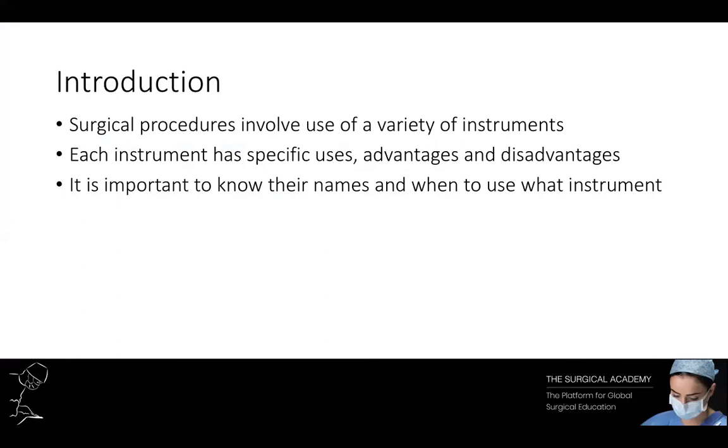Different specialties will have their own specific kit. Today we're going to cover the main instruments that are found in a general surgery set for an open abdominal surgery.